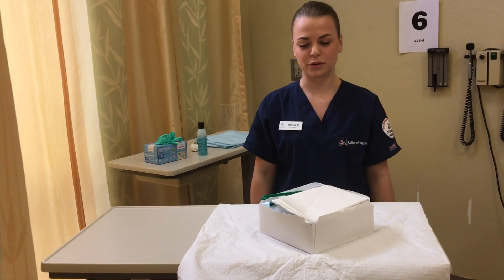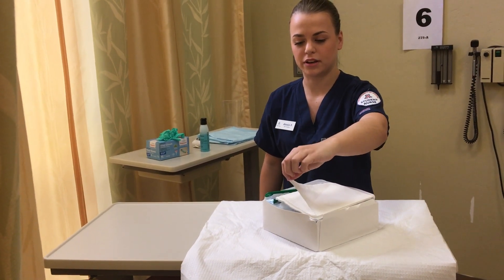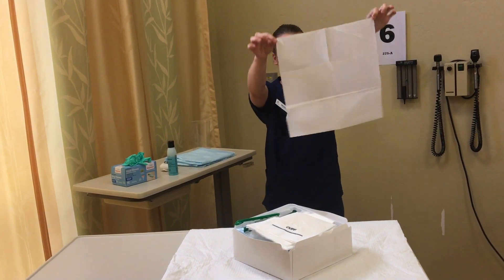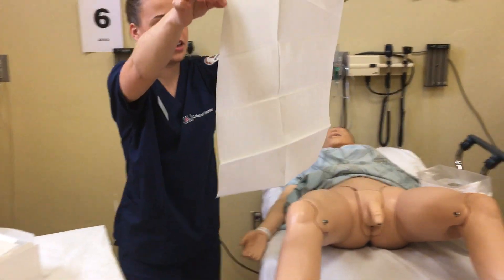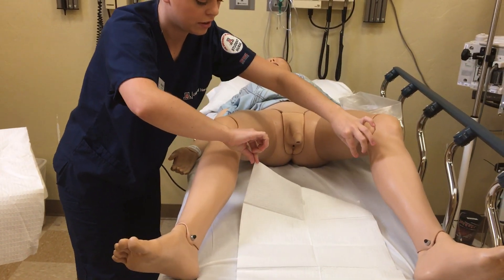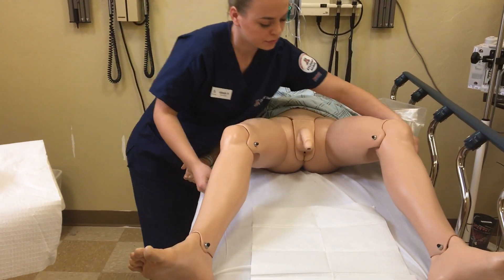I'm going to begin by grabbing the open end of the sterile drape, letting it open on its own, making sure the shiny side is facing me. I'm going to catch an air current and place it between the patient's legs. If it's okay, I'm just going to reach over you for a second. That's fine.